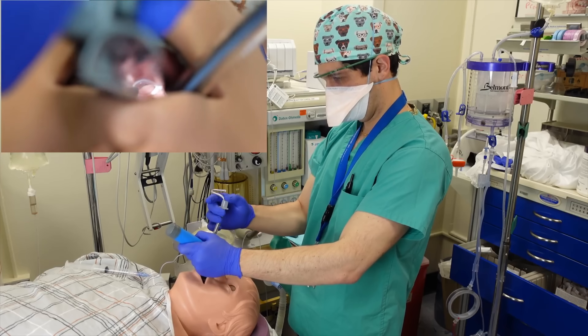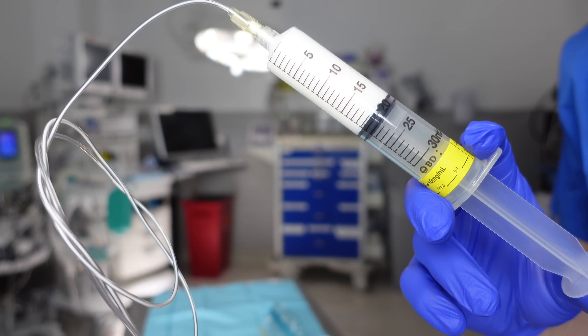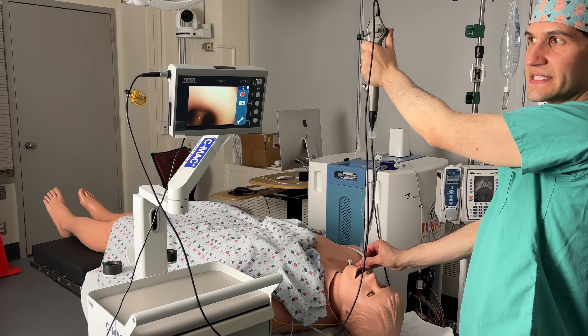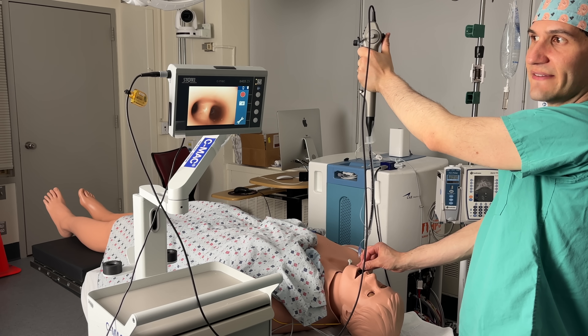For many different types of surgeries, anesthesiologists place a breathing tube into a patient's windpipe. This is almost always done after a patient has gone under general anesthesia and is completely unconscious. But in rare cases, we actually intubate patients while they're still completely awake. My name is Max Feinstein and I'm an anesthesiologist filming here at the Mount Sinai Hospital in New York City. In this video, I explain why awake intubations might occur and go through how they're done step by step.